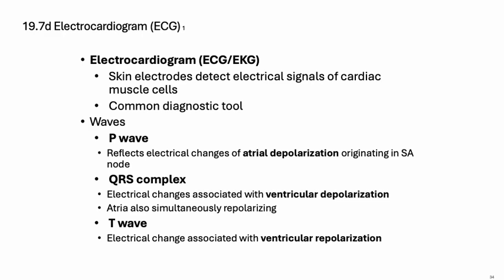So we're going to continue here, and this will be our last part for this section, and then we'll move on to some new material. But in this last part, what we're going to look at is our electrocardiogram, right? So you may have heard of an electrocardiogram. It is often abbreviated EKG or ECG, depending on what text or what source you're using.